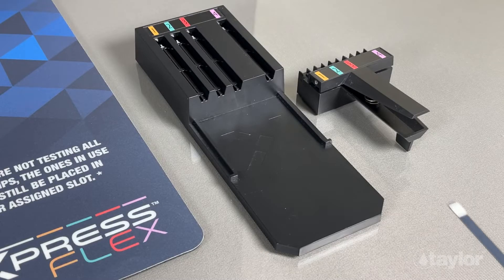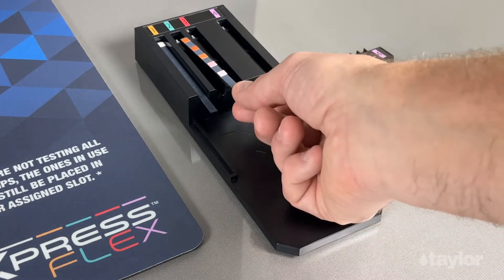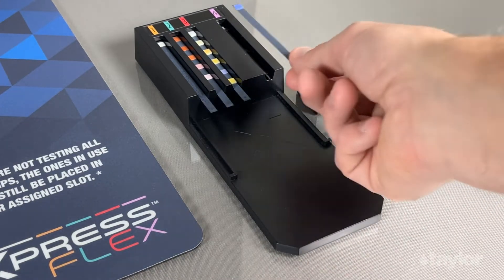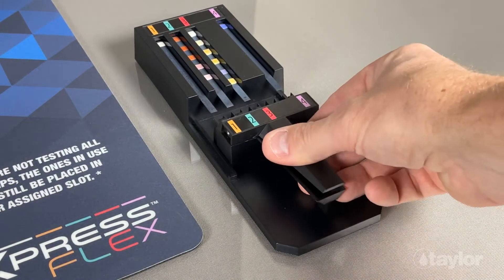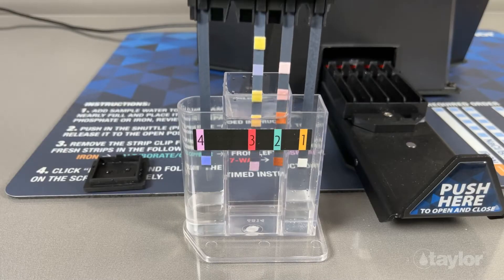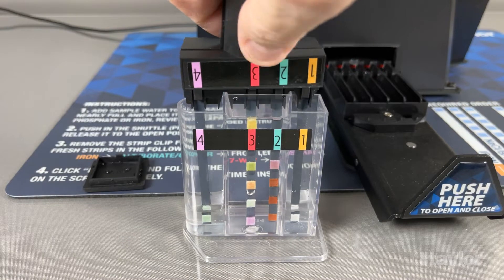Add the Flex 1 strip, Flex 2 strip, Flex 3 strip, and Flex 4 strip to the strip loader, and use the strip clip to pick them up. Dip the test strips into the test vial, remove, and place the strip clip onto the shuttle.